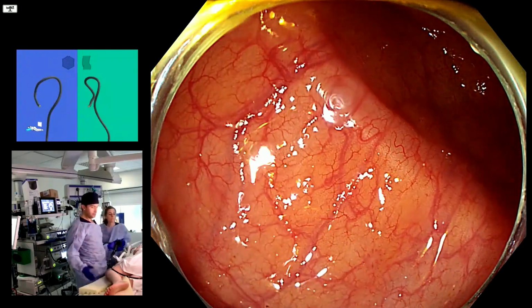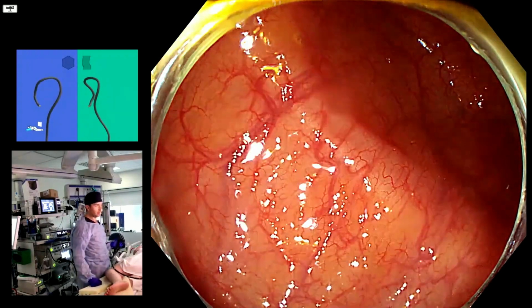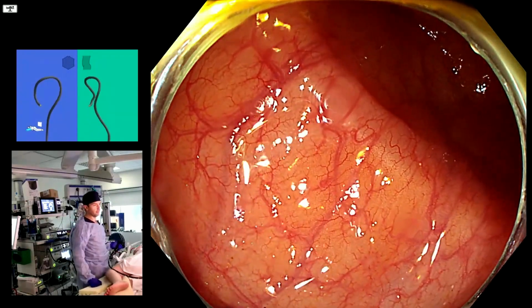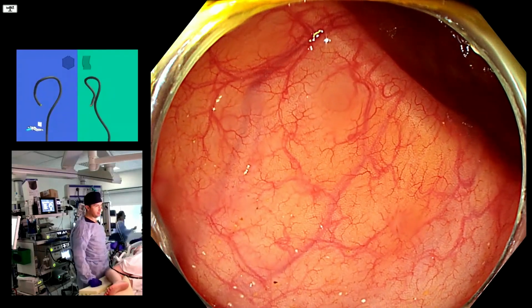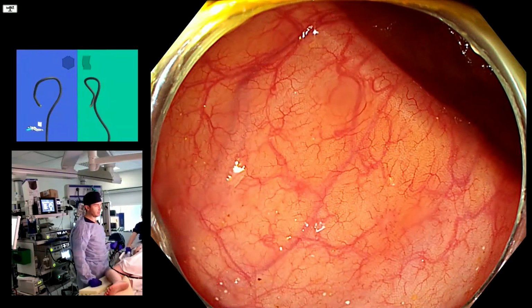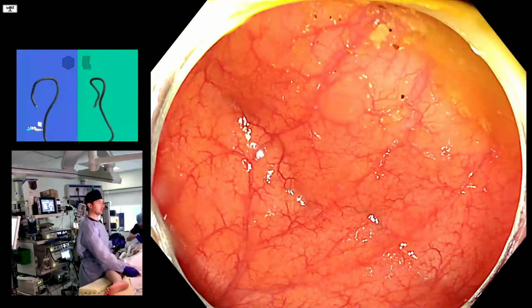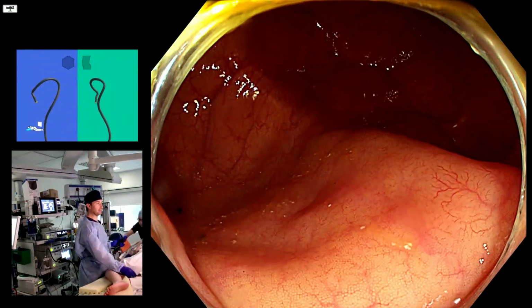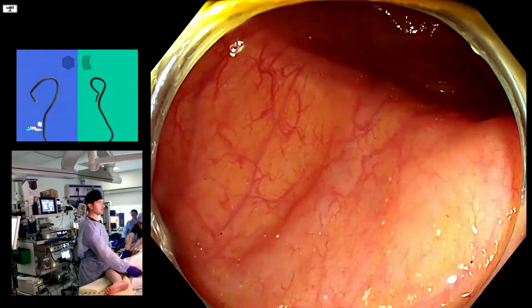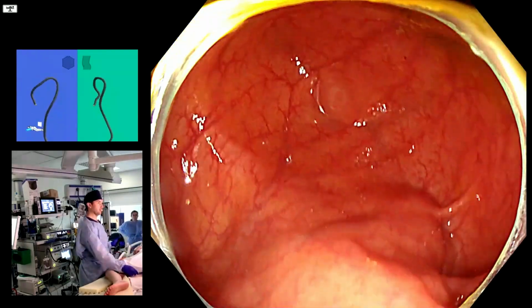So I didn't move the endoscope during that. I tried hard not to move it because, patients under anesthetic, it's quite difficult to move them. Can be much easier if the patient is awake. And now look, so let's get the view back, and then we'll see whether we can better see the appendiceal orifice in the caecum. So actually I'm in the caecum, and you can see from the scope guide position how easy it is for me to move from the caecum back into the right colon.